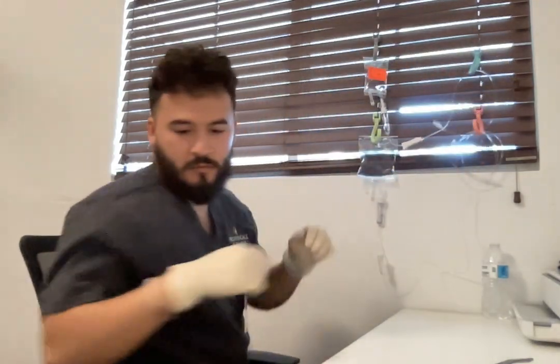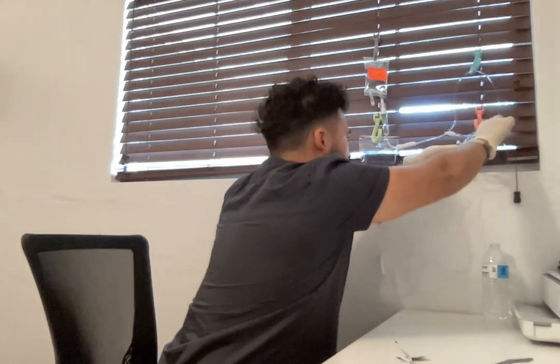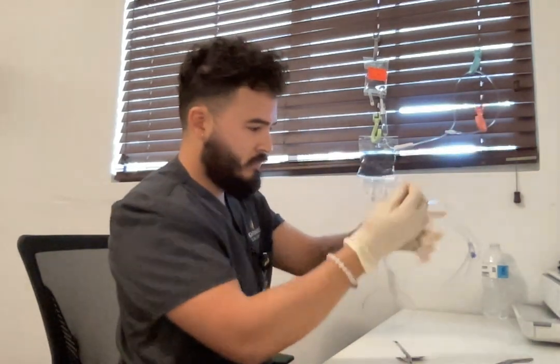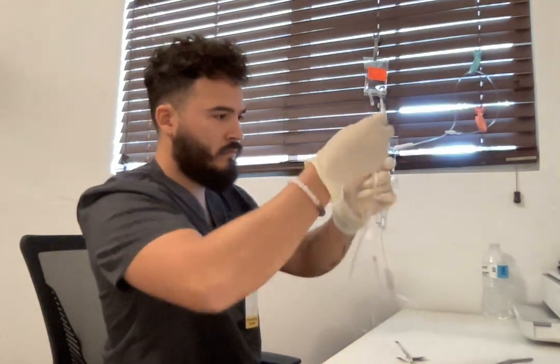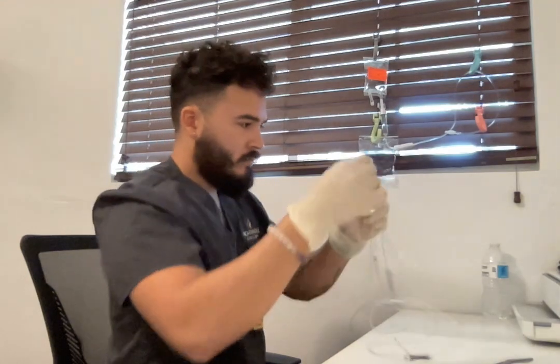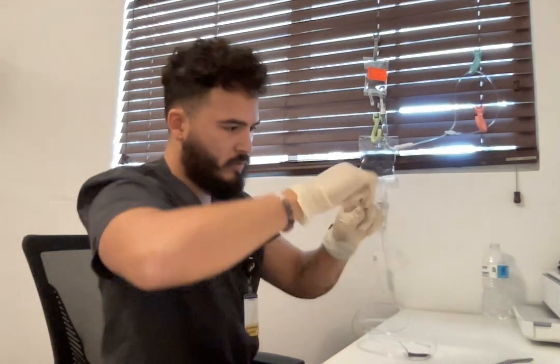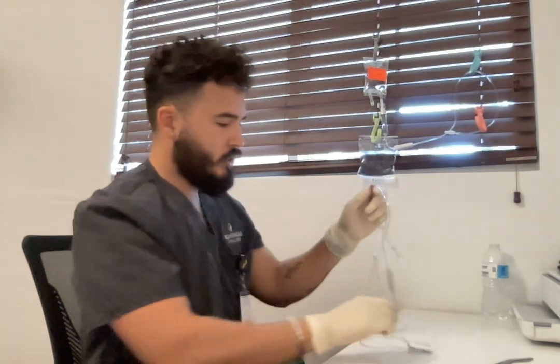Alrighty. So now we're gonna clean our Y port. So clean the Y port really good. Let it air dry.